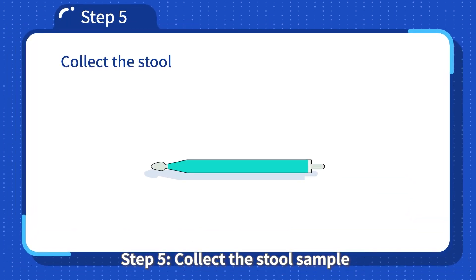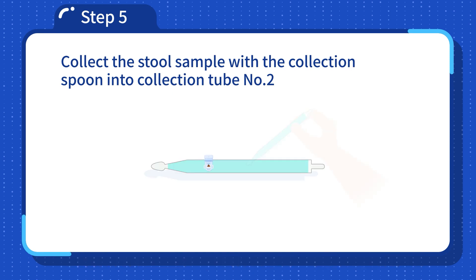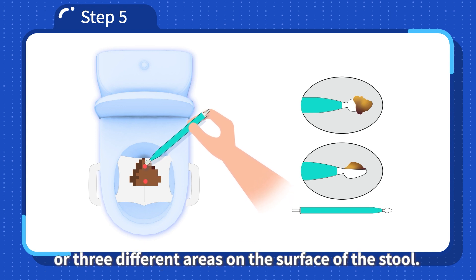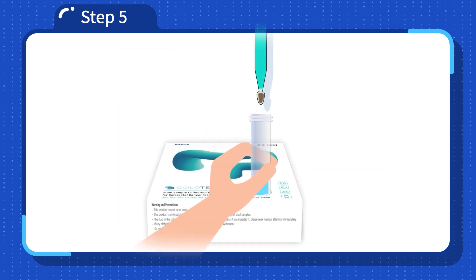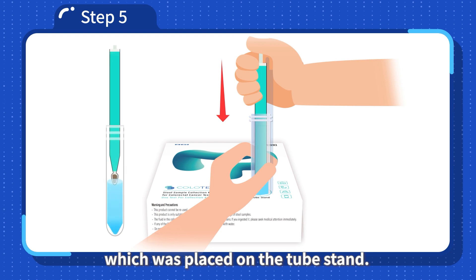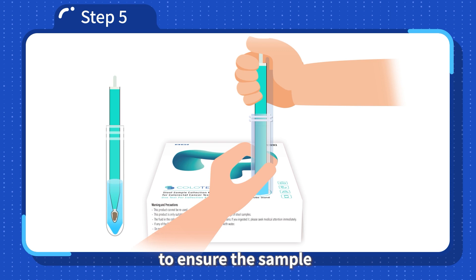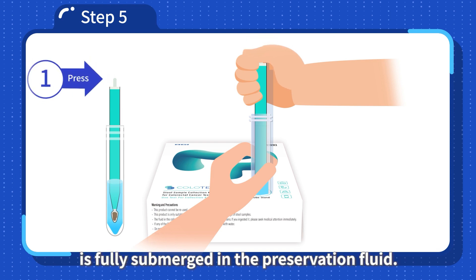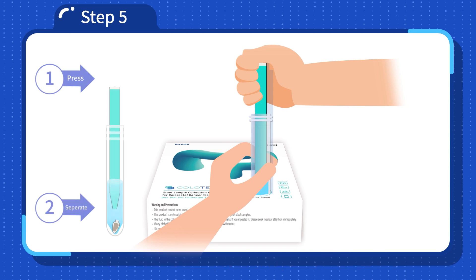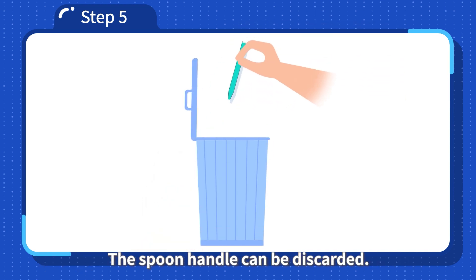Step 5: Collect the stool sample with the collection spoon into collection tube number 2. Use the collection spoon and collect one full spoon of stool sample from two or three different areas on the surface of the stool. Insert the spoon with the stool sample back into collection tube number 2, which was placed on the tube stand. Push the spoon towards the bottom of the collection tube to ensure the sample is fully submerged in the preservation fluid. Press on the top of the spoon handle to detach the spoon from the spoon handle, then gently pull the spoon handle out of the collection tube. The spoon handle can be discarded.